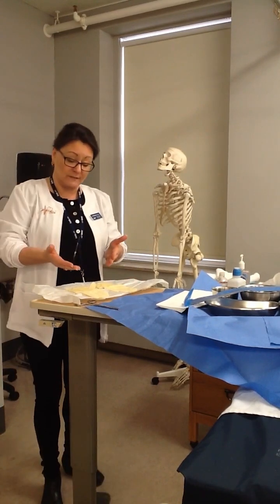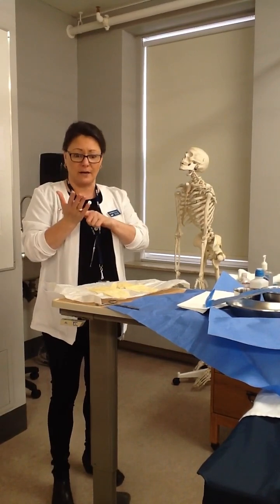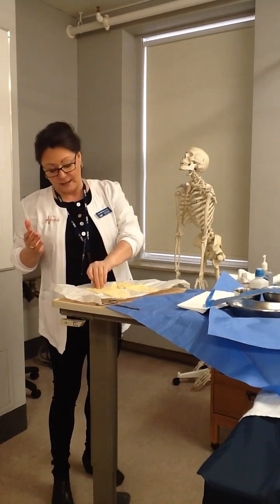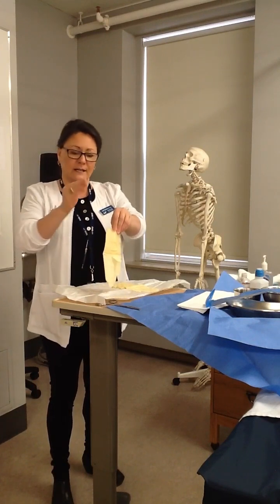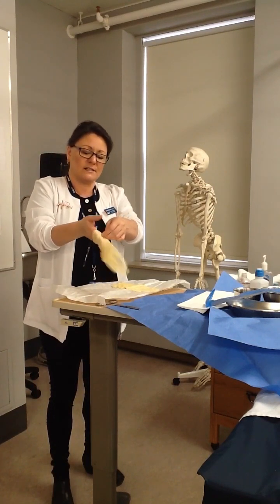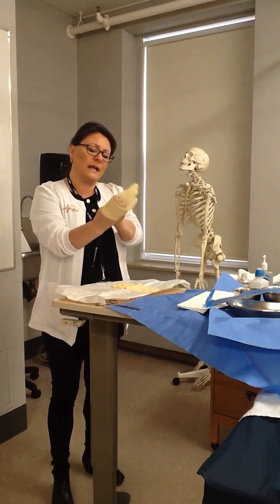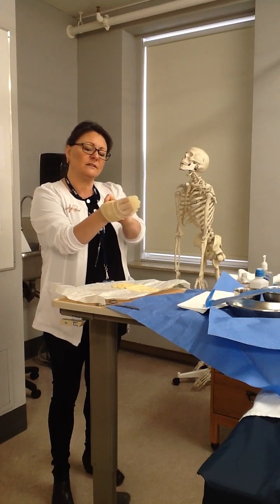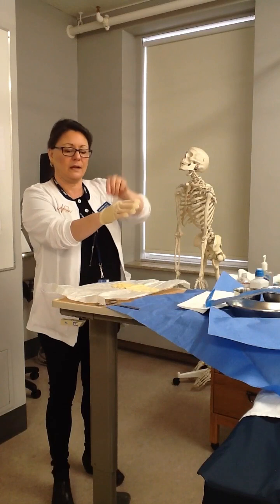I can see my two gloves sitting up, right and left. I'm a dominant right-handed person, so I'm going to apply my right glove first. I'm going to pick up the cuff at the bottom of my right glove and hold it above the package. I'm going to tuck in my hand, and start sliding it in. As my thumb finds its home, I'm going to turn my hand up and just be gentle. I want that cuff to stay right there at the knuckle line.